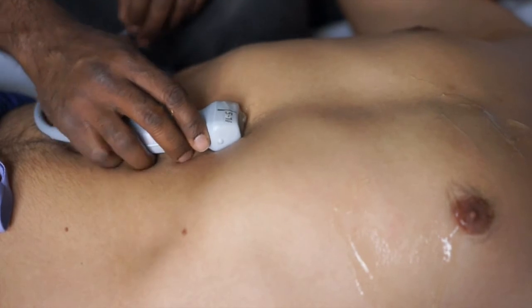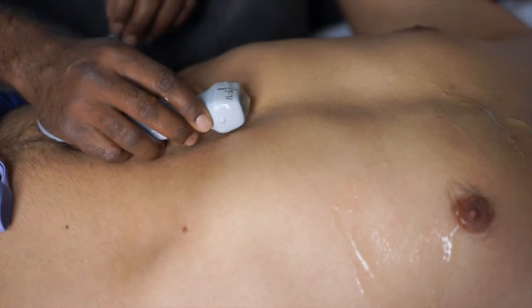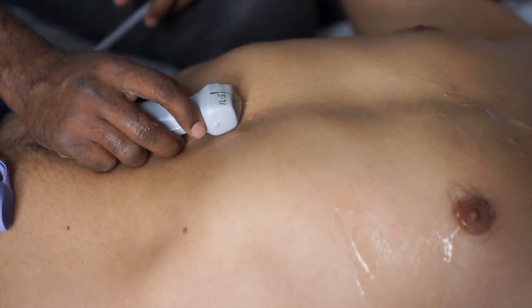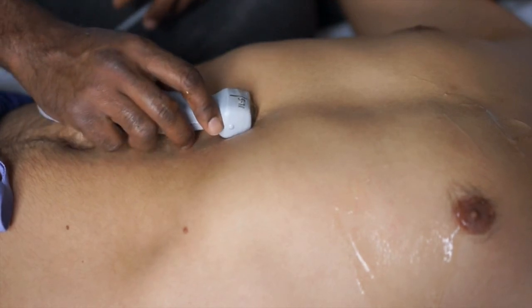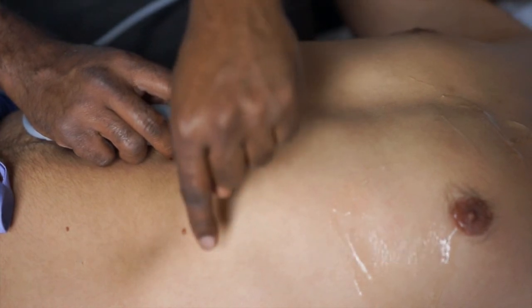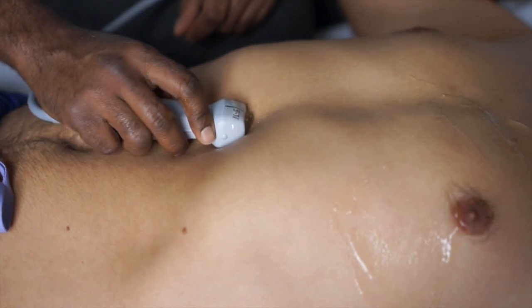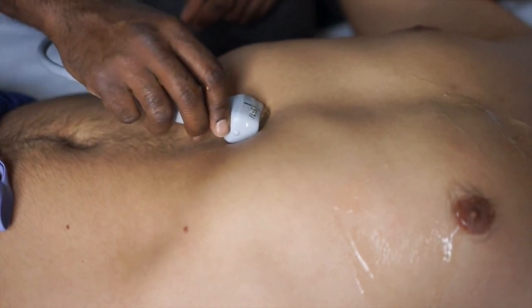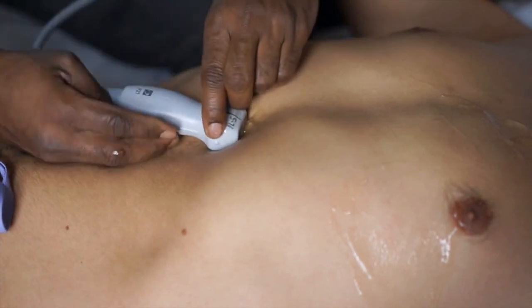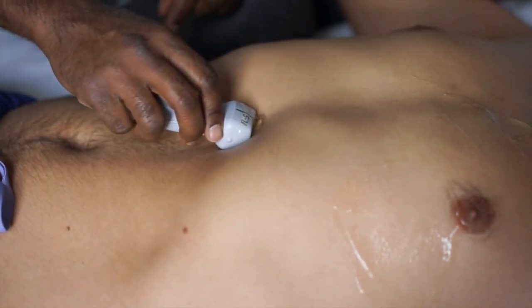The next view is the subcostal 4-chamber view. To obtain this view, firstly you place the patient in a supine position, and then you place the probe just below the xiphisternum with the index point pointing towards the patient's left flank. You may have to angle up or down to get the proper image as you are viewing the heart through the hepatic window. Occasionally, you may have to rotate slightly clockwise or anti-clockwise to get the best image.